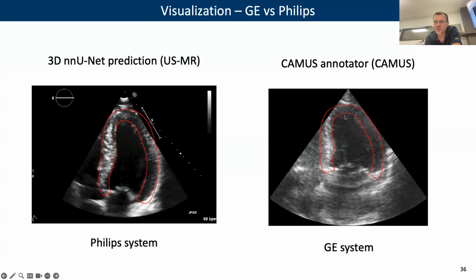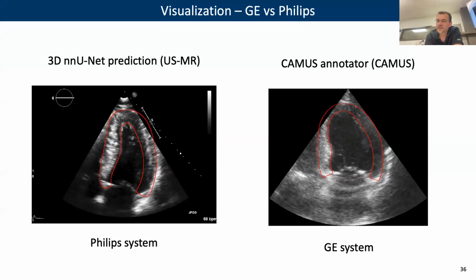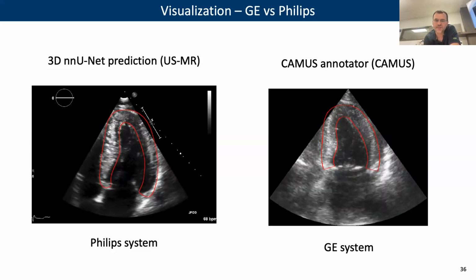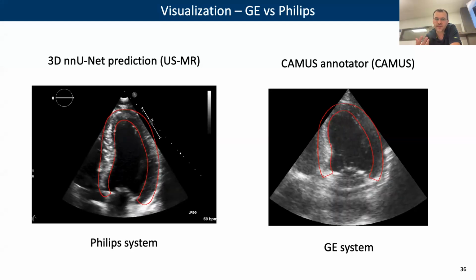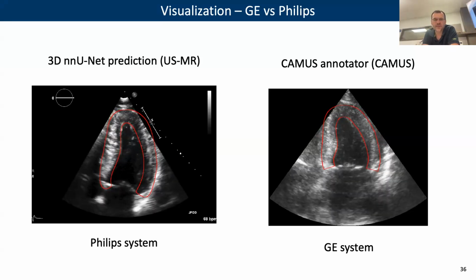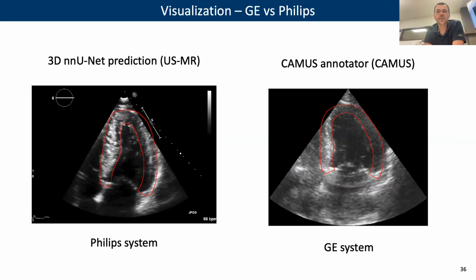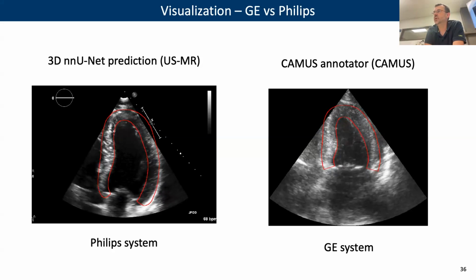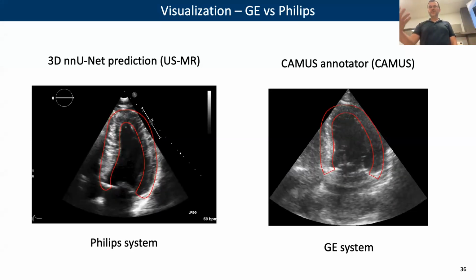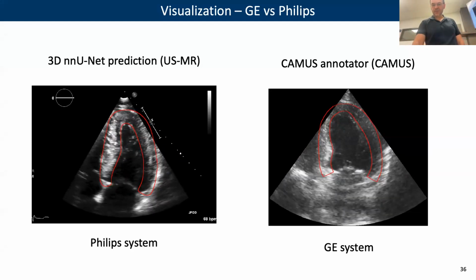So you see, this is a particularity of this annotator. And this is exactly what happens here. So you see, we test on another system which has more contrast, for instance here, where the structures can be better seen. So we can expect that the distribution is not exactly the same, but even with another distribution, this particularity remains. So it's also a way for us to say that, effectively, we really learn the hand of the expert, the way he drew the contours, and we reproduce this, whatever the equipment we use and the data that we are processing.